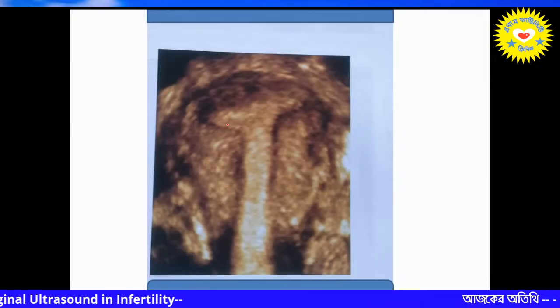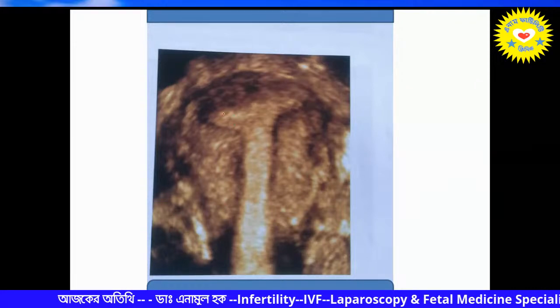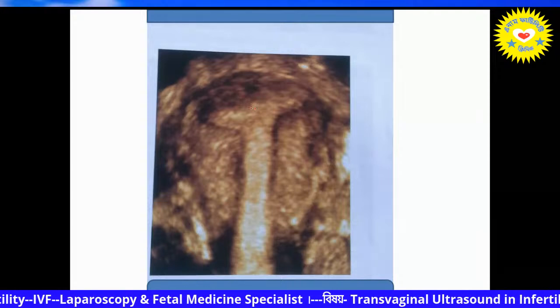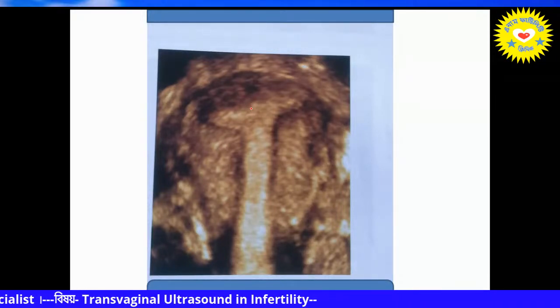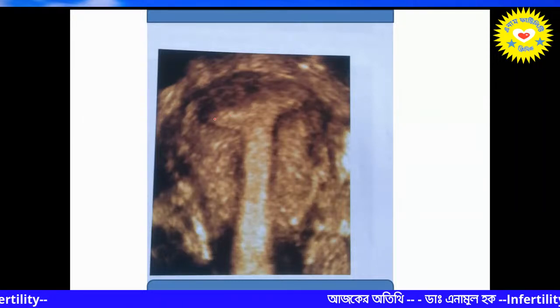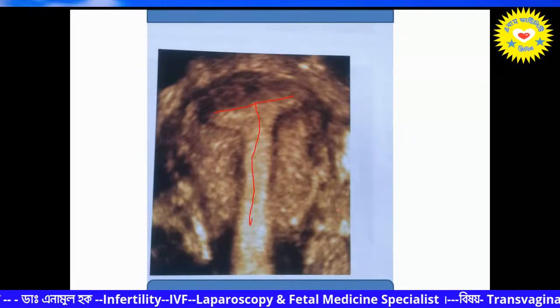And the last, class 7 or type 7, is, as you know, the T-shaped uterus. This is a very rare form of endometrial abnormality, mostly related to diethylstilbestrol drug anomaly. And this is the endometrium, a typical T-shaped endometrium. You see, this is the typical T. This endometrium, this is T-shaped uterus.